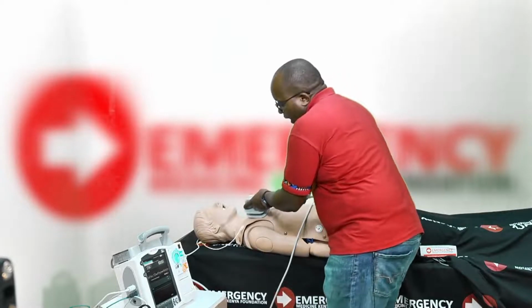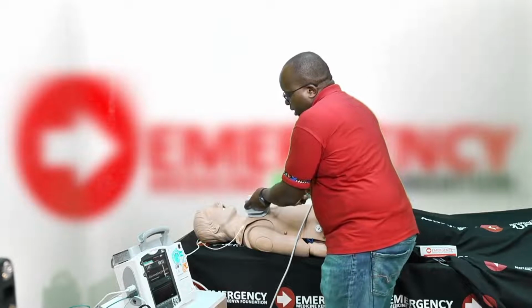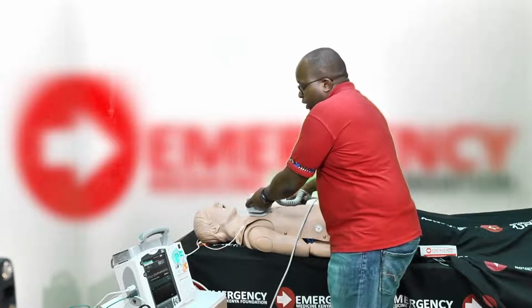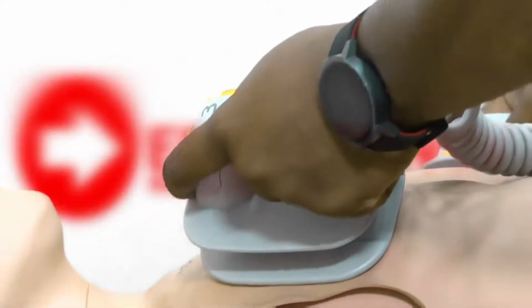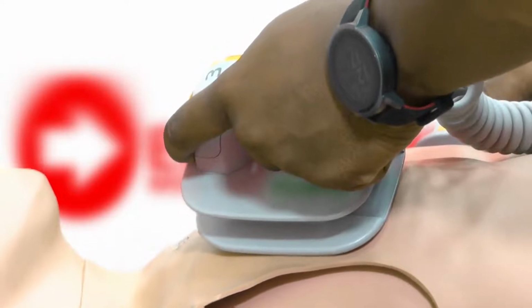Now, I want to highlight, as you can see, there are some lights on these paddles here. The lights essentially indicate if your contact with the skin is good enough. If it's red, it means bad contact. If it's orange, fair enough, but you ideally want to be in the green zone to show that you have applied enough pressure and have good contact with the skin.